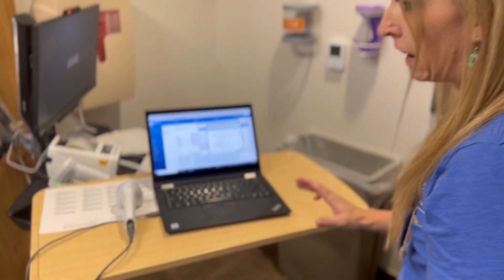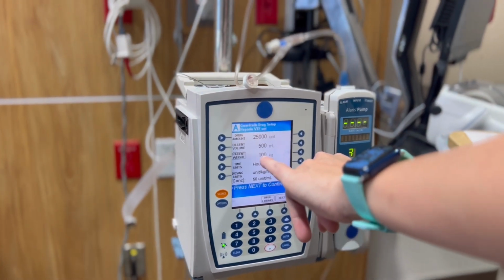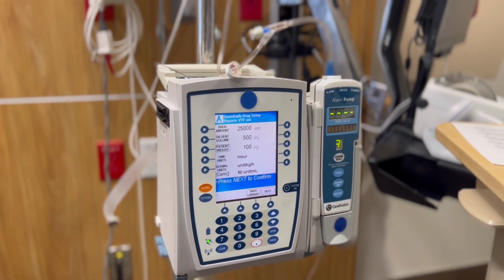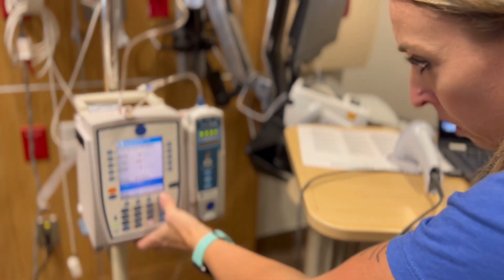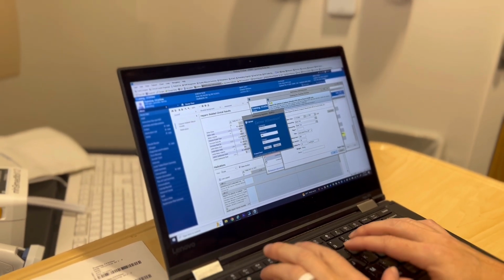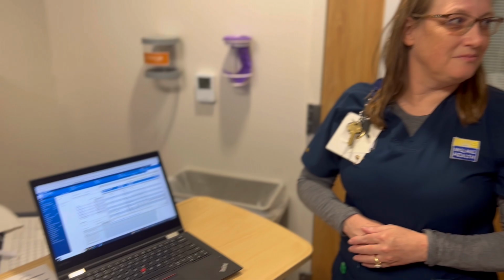The only other thing I like to check as a second nurse verification is I go into setup and make sure that this patient weight is not over 100. So I always verify that, because if you're getting a dosing error on the pump, that might be what is incorrect on there. So after everything's correct, I would go ahead and say, yes, Linda, looks great. You did a wonderful job. Hit start on that, and then go ahead and sign it in here. Perfect. And now Linda can sign her part if she's all done giving the meds.